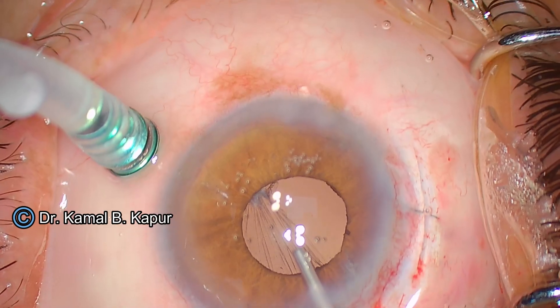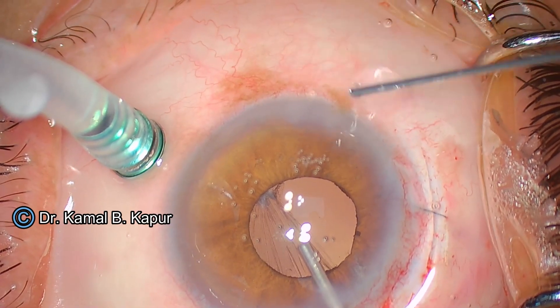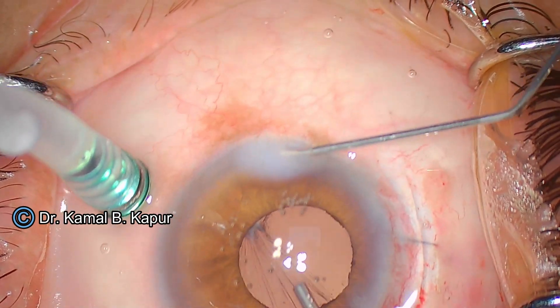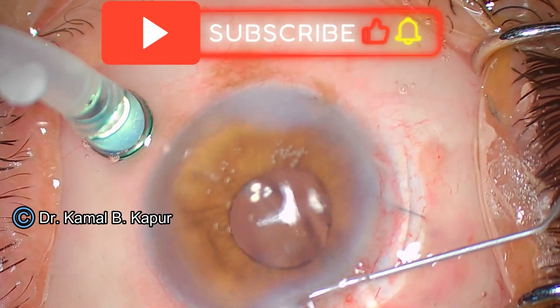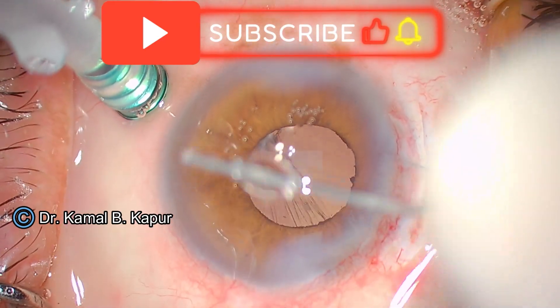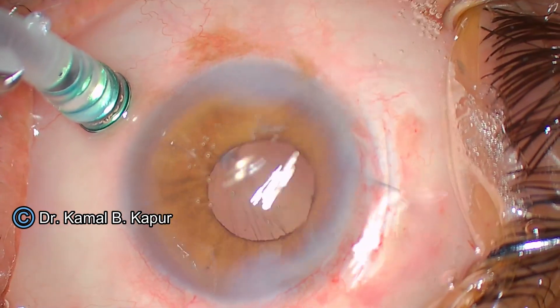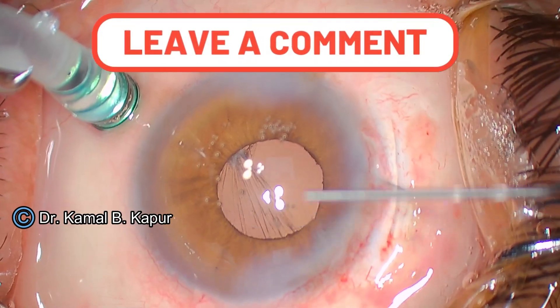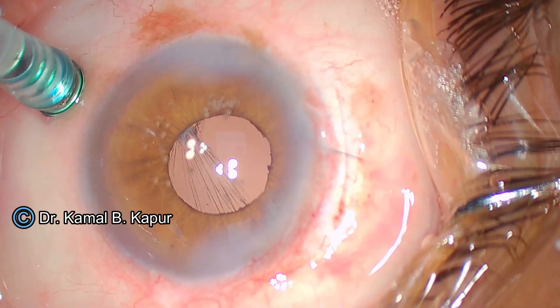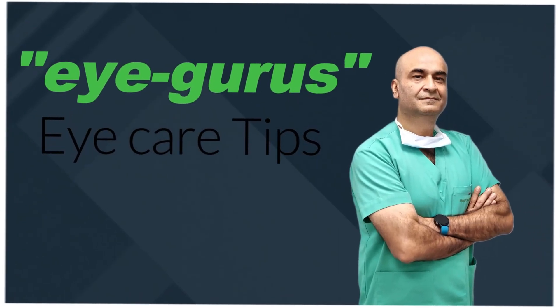We infuse fluid from both the scleral port and the side port irrigation, and hydrate our side ports. The result is a very round pupil, a clear IOL, and a watertight wound. Using the beautiful invention by Dr. Neha — the spiral automatic IOL cutter — we were able to take the lens out successfully. Thank you.